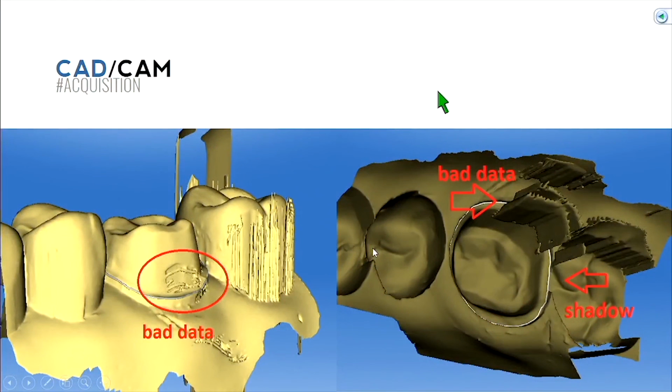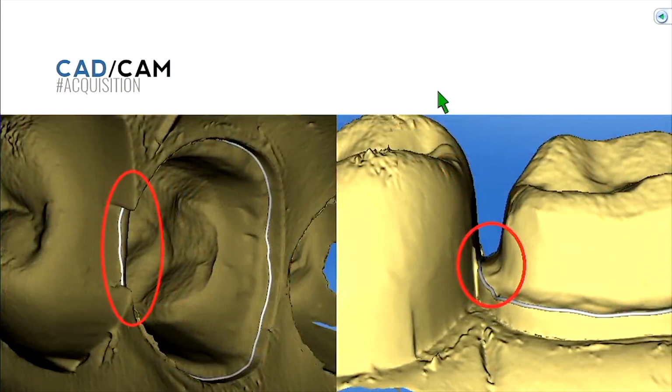Okay. We also get some submissions that just have bad data. This obviously isn't the contour that your prep was. Okay, so make sure to look around and see that it looks like a tooth prep or a crown prep. Okay, so these things should be obvious to us, and we should be able to detect these right away. Okay. Another thing that we saw, not a lot, but a few students didn't prep their margin.